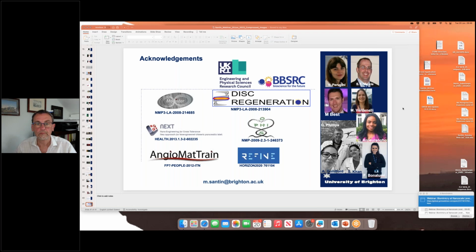Have the biophysical and structural properties of the substrate, stiffness and nanotopography been analyzed? And if so, can they be controlled? So the nanotopography, I showed in my very first slide the scanning electron microscopy showing the controlled nanotexture produced by PhenoDrive when it is used as a coating for tissue culture plastic. So that has been done. In terms of stiffness, again, that's a very good question. I think we have not done it, but it depends.